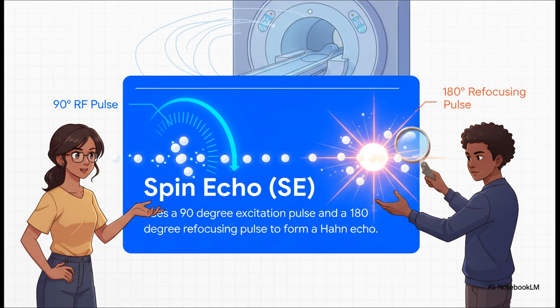It kicks off with a 90-degree RF pulse to tip the protons into the transverse plane. But because the magnetic field is never perfectly uniform, those protons quickly fall out of sync with each other. They dephase. To fix this, the scanner fires a 180-degree refocusing pulse at exactly half the echo time. This brings all those spinning protons right back into phase, creating a loud, clear signal called a Hahn echo.